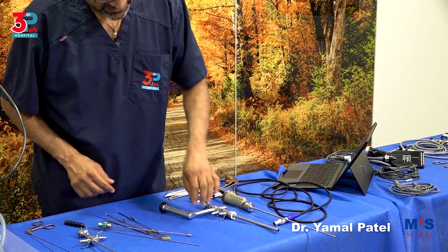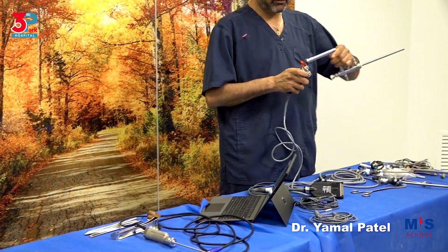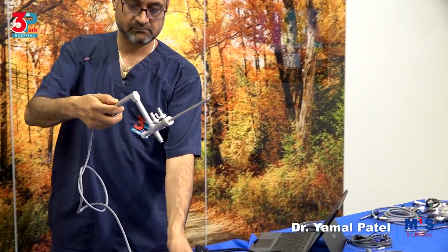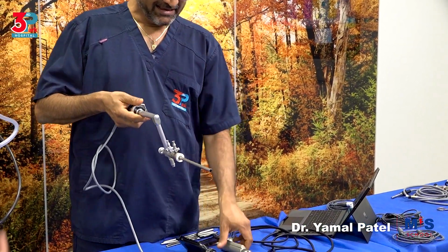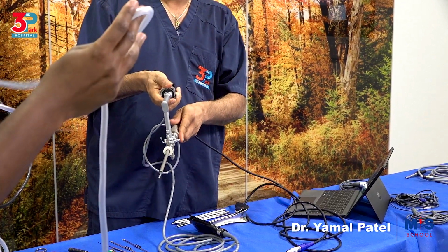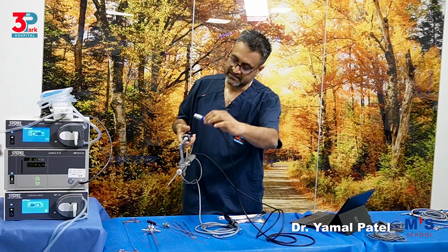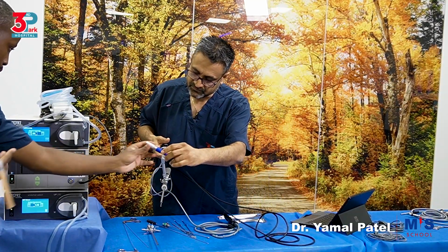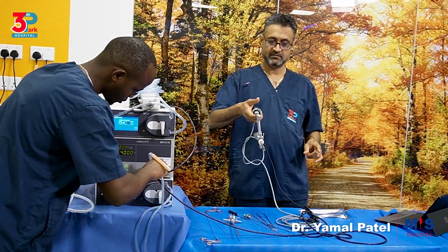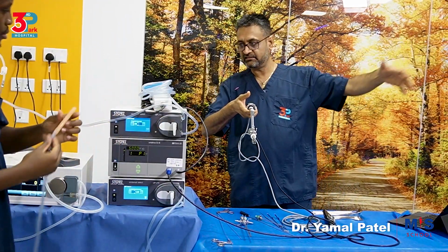We have the eyepiece here which connects to the camera. So that will be connected to the camera like that. And this is where the shaver blade will go in, and that will be used for shaving, as you're seeing. This is going to be connected to the motor. So we'll just show you how it's connected to the motor gently. And this then connects to the camera processor.